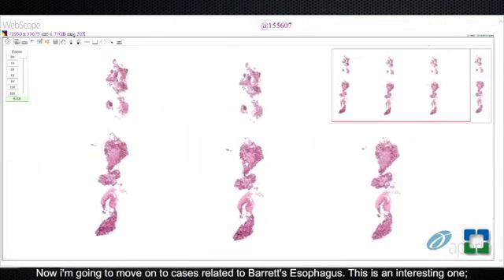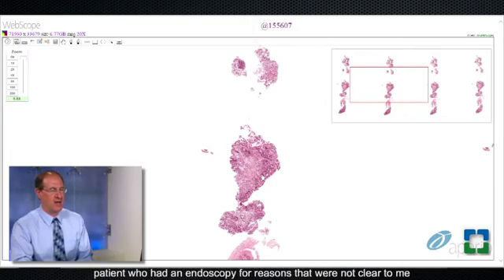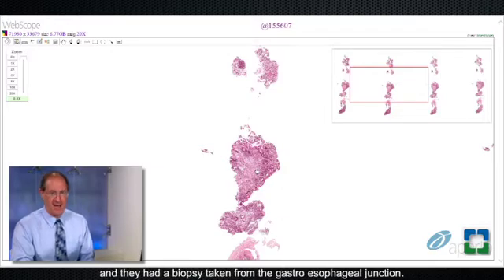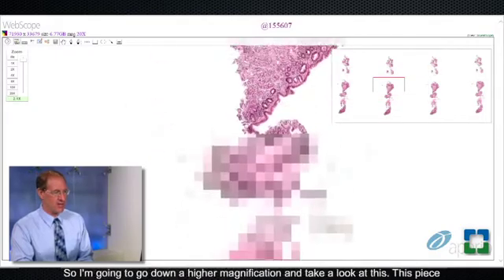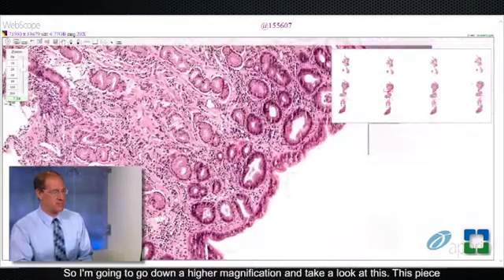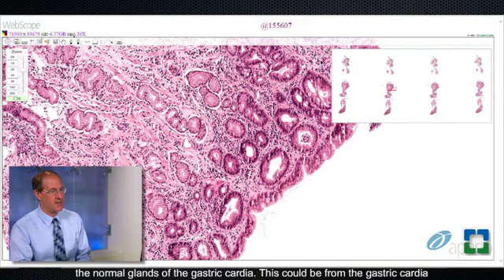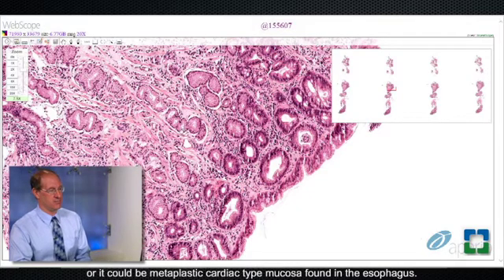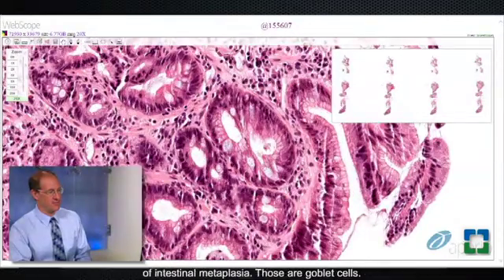Now I'm going to move on to cases related to Barrett's esophagus. This is a 56-year-old male patient who had an endoscopy for reasons that were not clear to me, and they had a biopsy taken from the gastroesophageal junction. In the absence of knowing anything about the endoscopic features, all I know is they're biopsying from the gastroesophageal junction. Going to higher magnification, this piece looks like inflamed columnar mucosa. Looking at the glands, these resemble the normal glands of the gastric cardia — this could be from the gastric cardia, or it could be metaplastic cardiac-type mucosa found in the esophagus. Regardless, we see clear-cut evidence of intestinal metaplasia.